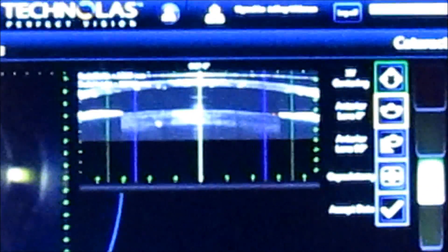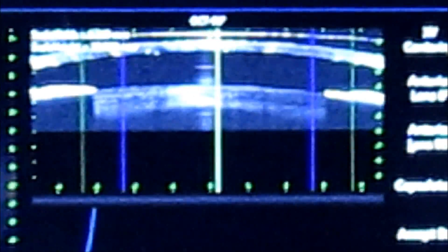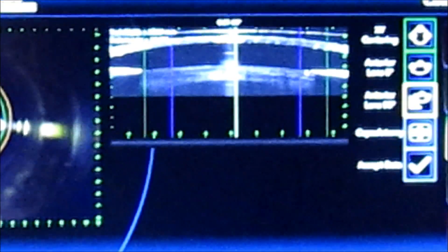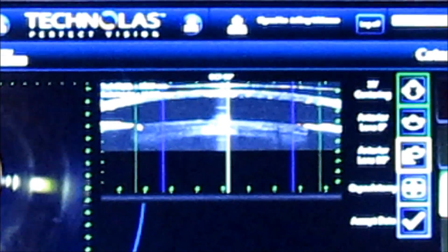Then in two areas, we'll mark just inside the pupil, just inside the iris, at 90 degrees and 180 degrees. Once we do this, we'll mark the center of the cornea on the OCT image.